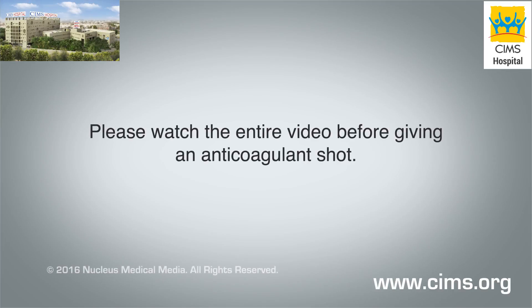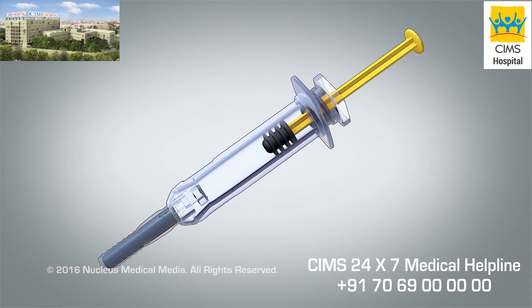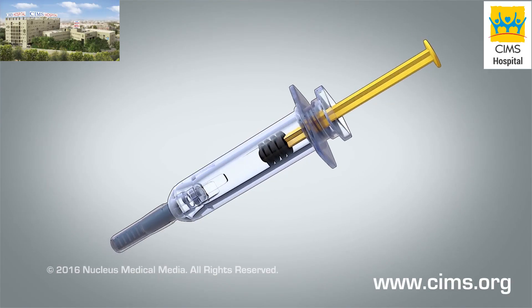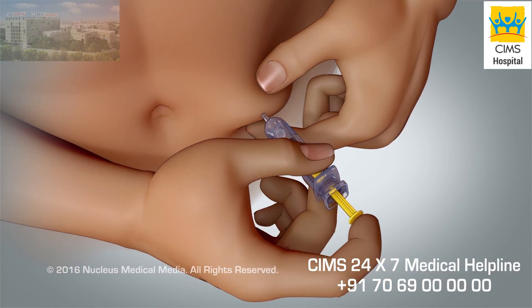Please watch the entire video before giving an anticoagulant shot. This video will teach you how to give yourself a shot of anticoagulant medicine, also called a blood thinner. Blood thinners help prevent clots from forming inside your blood vessels.